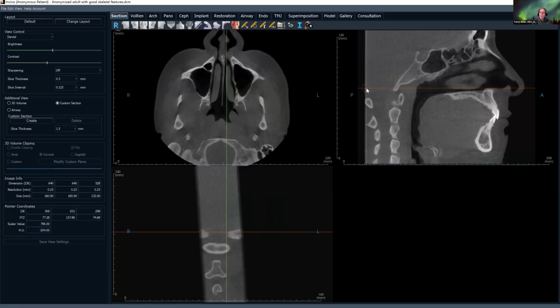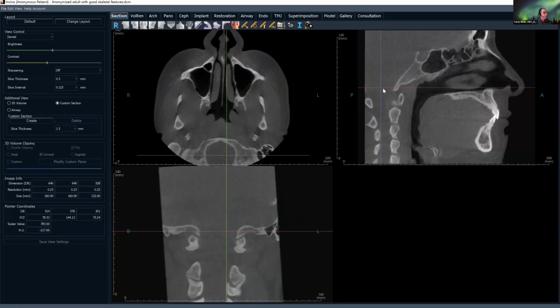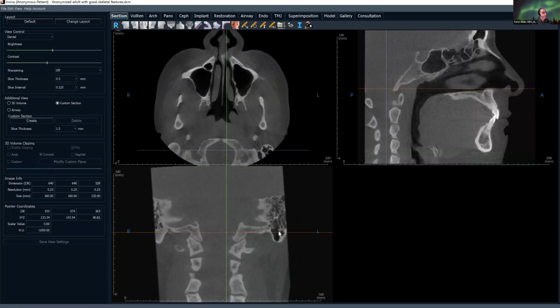So now in the bottom left panel, the coronal view, we're going to be scrolling from the posterior to anterior. And some of those same structures will reappear. Sometimes I look at them, sometimes I don't, because I feel like I've already looked at them here. But when I scroll from the posterior anteriorly, the first thing I begin to look at are the mastoid air cells. It's fairly uncommon to have them opacified. I've only seen it maybe a few times, 4 or 5 times possibly. But it can tip off that there's something going on if these are fluid filled or soft tissue filled. And so this is the mastoid air cells.